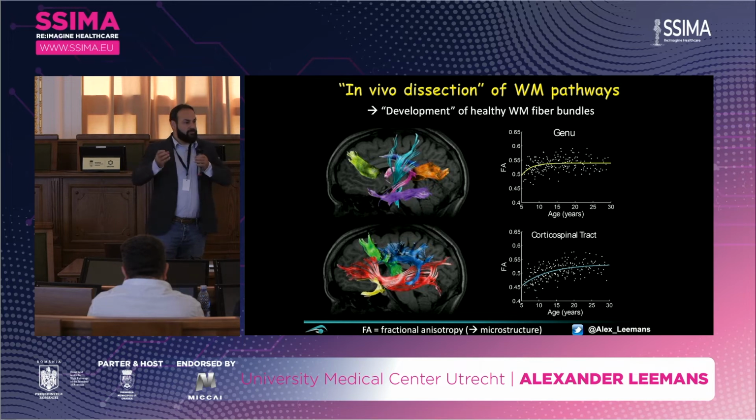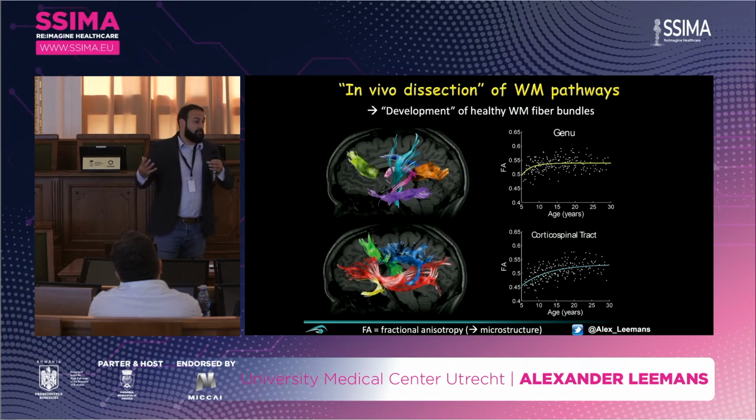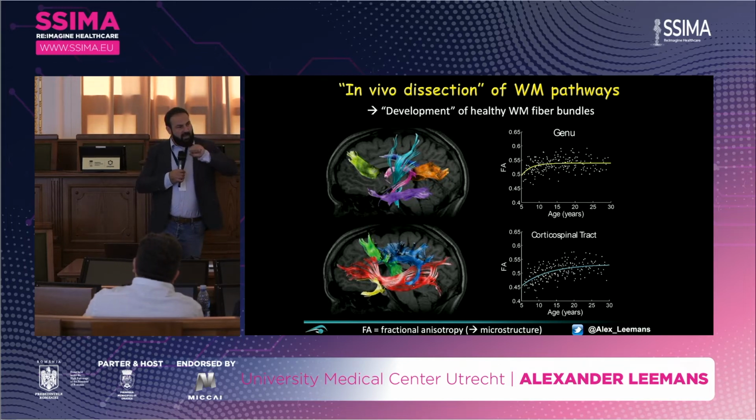What happens to the diffusion process? Well, the diffusion will change, right? So for instance, the anisotropic behavior will become different. This is quantified with something called fractional anisotropy. It basically states to what extent is my ellipsoid cigar-shaped. Well, if it's very cigar-shaped, we think of it as being healthy, right? Very nice myelin, axonal filaments all intact. But if that degrades due to pathology, then this anisotropy goes down.